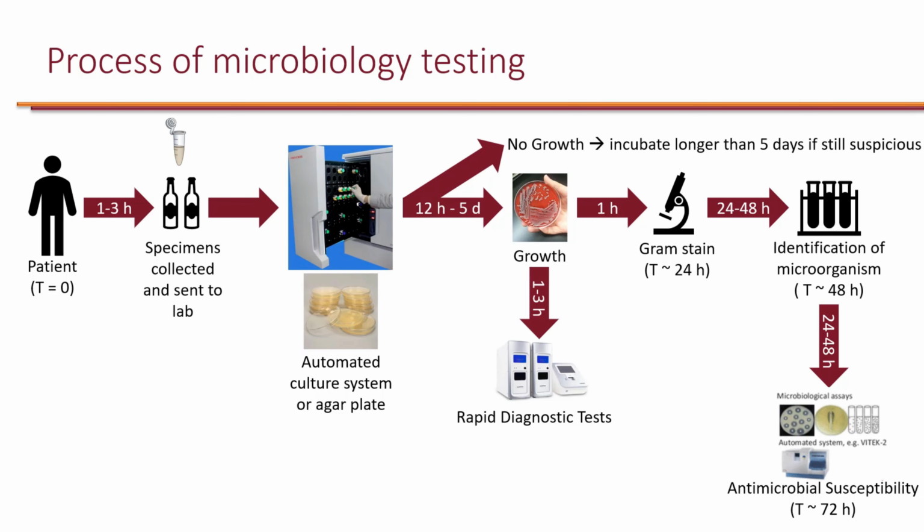Now, as technology advances, we have a rapid diagnostic test that can expedite this process. So, when we actually grow an organism, we can directly put some of these colonies into rapid diagnostic tests. And these rapid diagnostic tests will be able to very quickly, in a matter of anywhere between under an hour to just 2 or 3 hours, tell us exactly what the organism is and what the susceptibility results are.